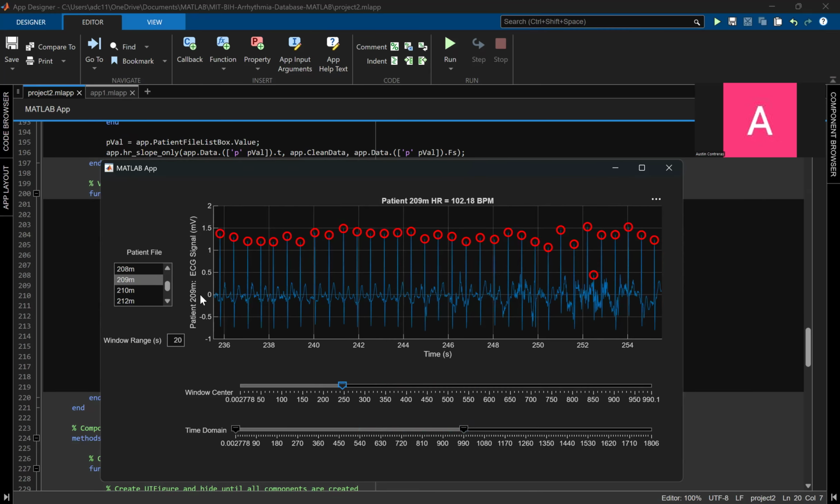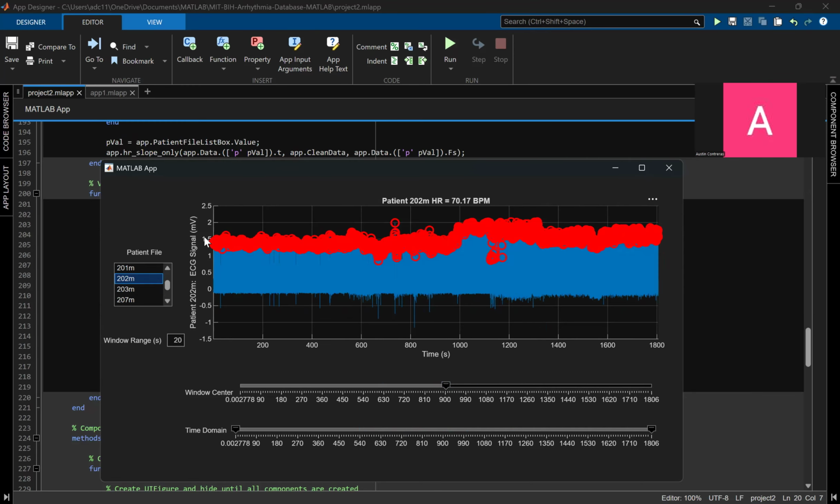You get more data. And then the heart rate is in the title function, and the y-axis label will change for every patient. And the GUI works. It might not be pretty with the colors, but the information is being saved correctly.